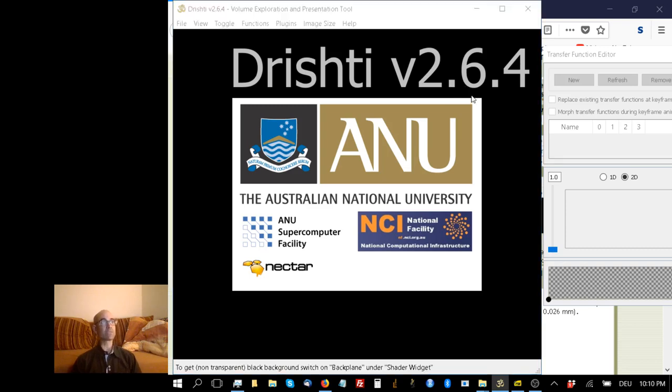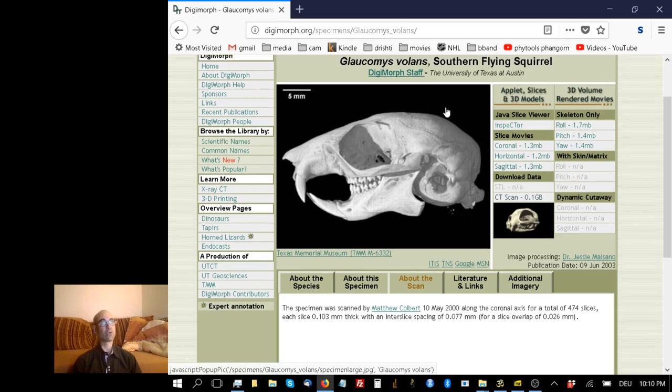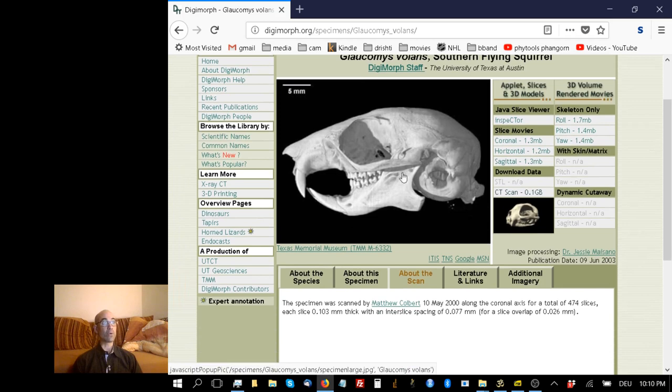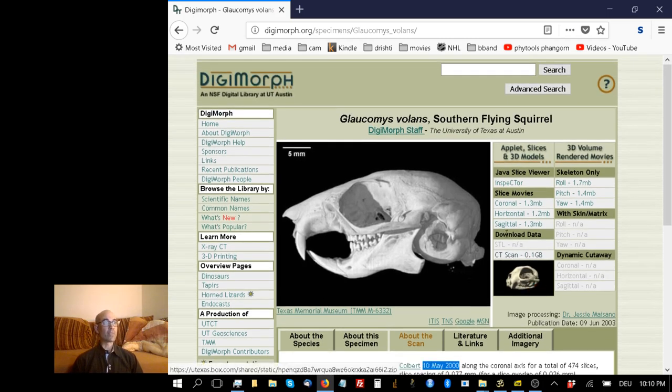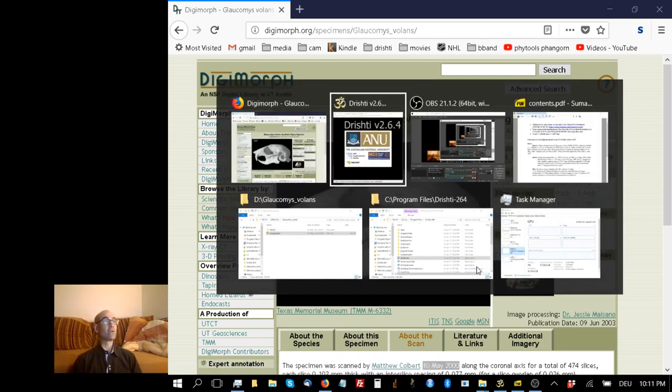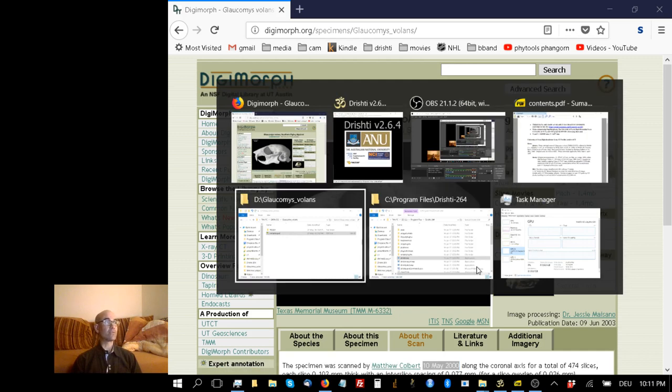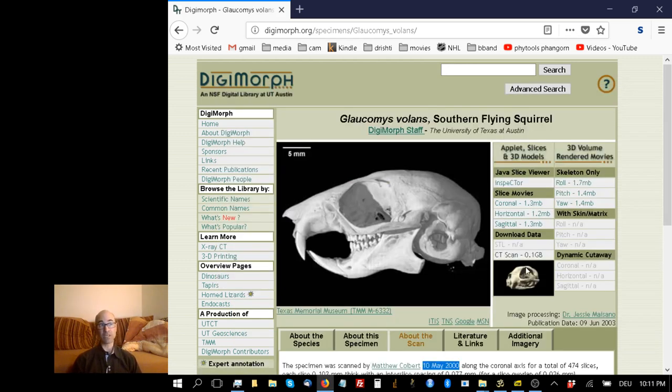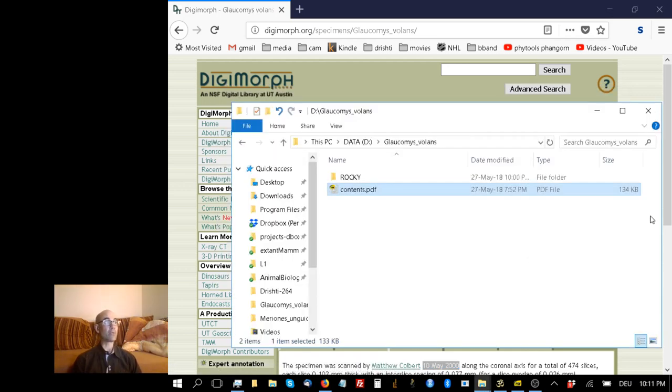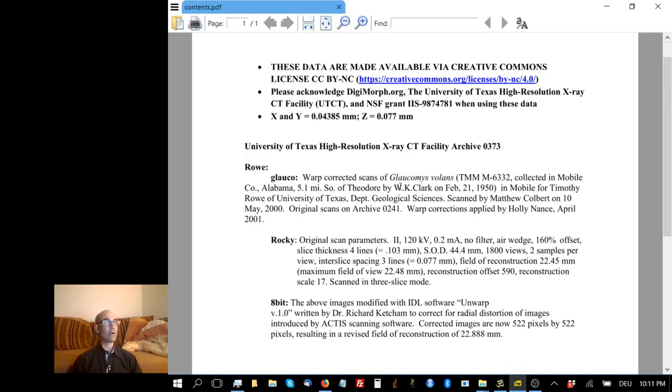I want to use a specimen that's derived from the University of Texas Digimorph website. It's a really old scan, actually, taken way back in the year 2000. So in computer years, this is sort of the lower Eocene. But it's an interesting scan and has some properties worth looking at briefly.